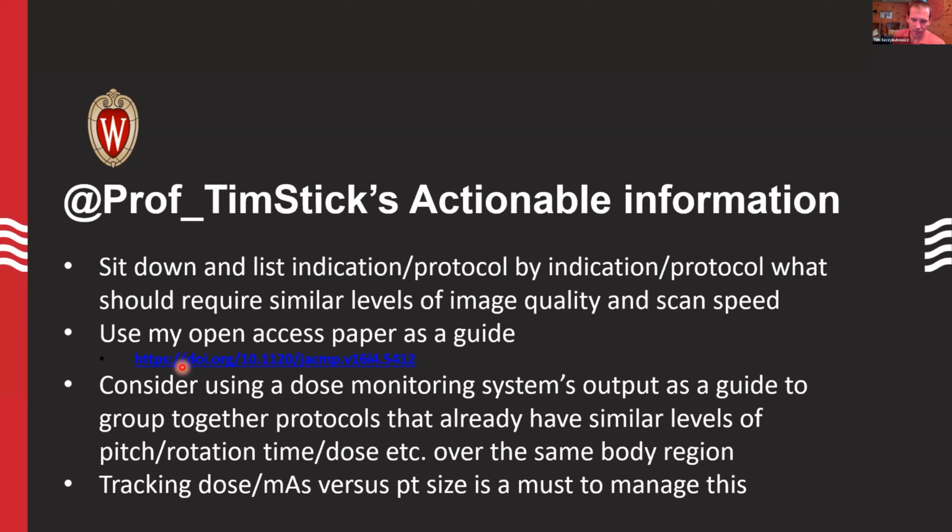We have this deck, say, for example, or this open access paper as a guide for how one could do that with some examples. Like, for example, you're probably not going to bin your virtual colonoscopy with your trauma abdomen, right? You're going to want a lot more dose on the trauma than you are on the virtual colonoscopy. So you wouldn't put those together. But maybe your cystogram and your routine abdomen, maybe those have a similar dose.